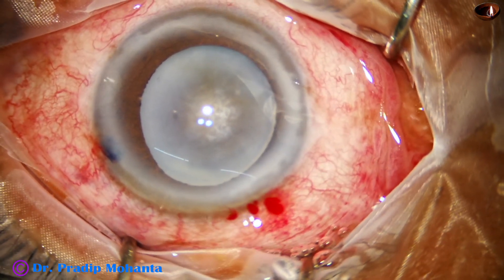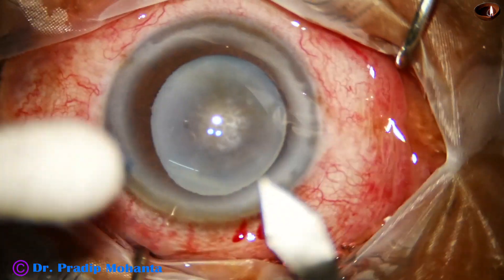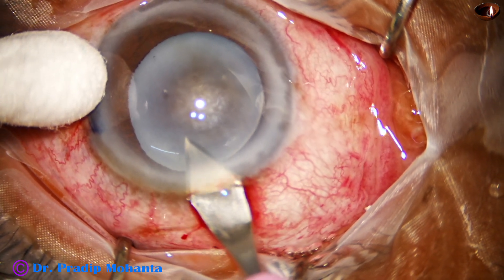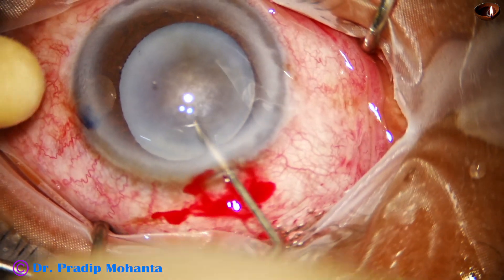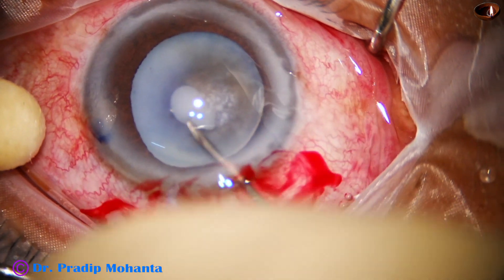The anterior chamber is filled with viscoelastic. The main wound is enlarged slightly with one cut so that entry of the phaco needle becomes easy. A hard nucleus is visible.